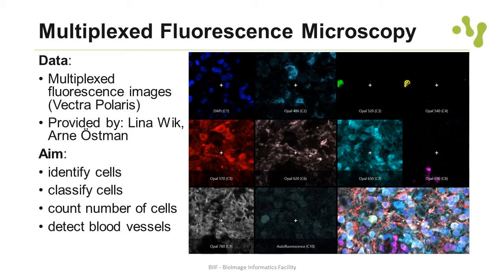The data that I based this introduction on is a multiplex fluorescence dataset, meaning we have 10 channels. One of these is the nuclei — standard DAPI — from a tissue core from a tumor tissue. Then we have eight markers that characterize the cells, so the absence or presence of these markers characterizes the class of the cells. What we are interested in is identifying and classifying the cells, counting them, and additionally detecting blood vessels in this tissue.